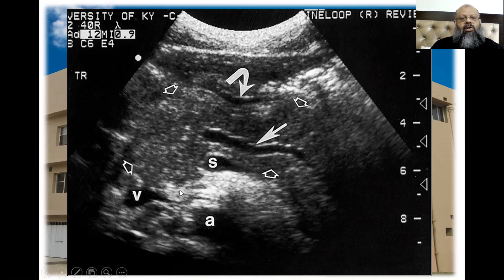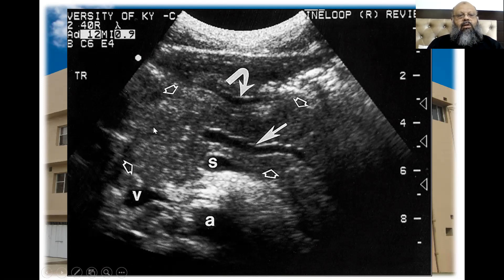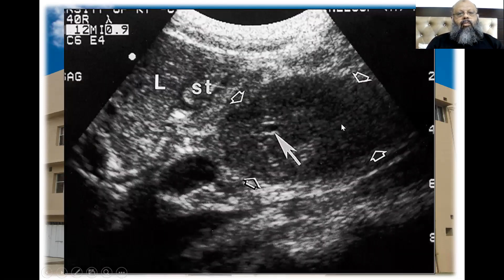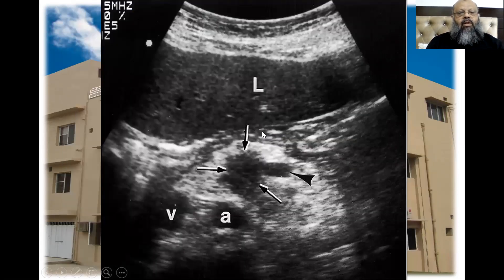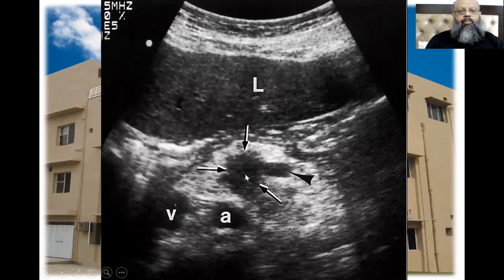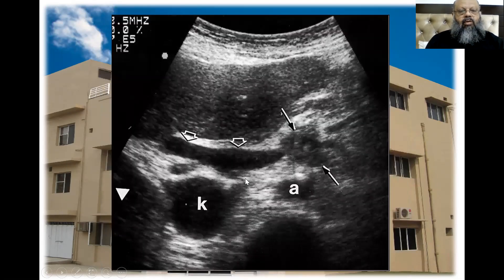In this case, we can see a mass at the head of the pancreas causing dilatation of the pancreatic duct. Pancreatitis — inflammation with dilatation of the pancreatic duct. This is another case in which you can see a mass causing dilatation — a mass at the head of the pancreas. Again, this is a mass causing obstruction.